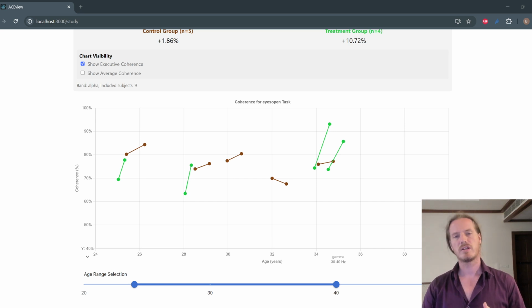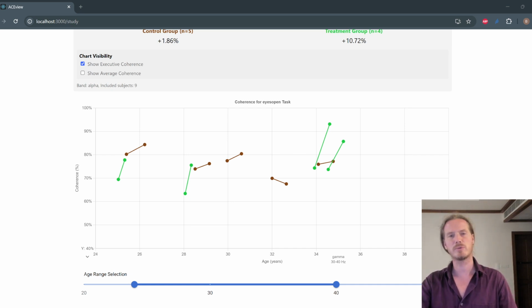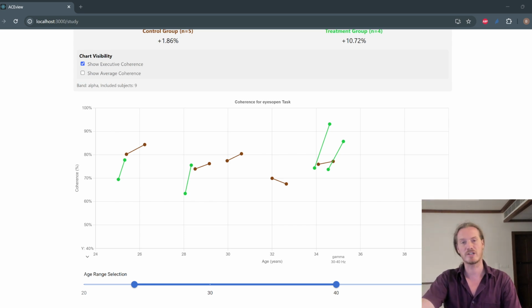At the moment, the analysis program that I showed earlier saves all of the data in the H5, and right now it does coherence and it does the spectral parameters. But it can do so much more. It would be some amount of work to add more modalities to it, and there are so many more interesting things that can be done other than coherence. So with a reasonable amount of additional development, more can be added. And then in this viewing program, we can visualize it all in whichever way we want.